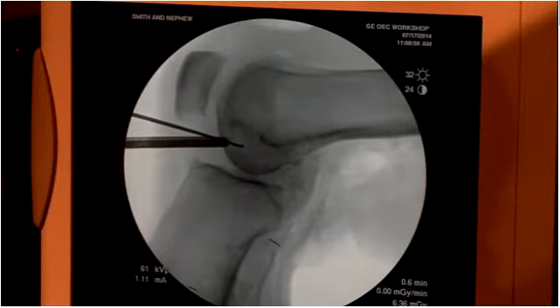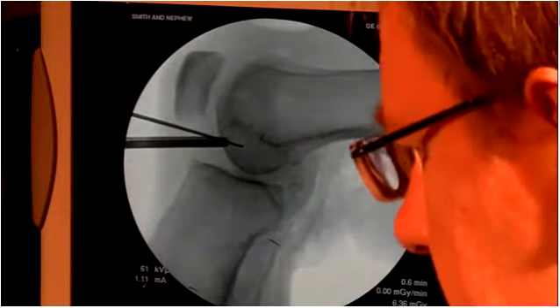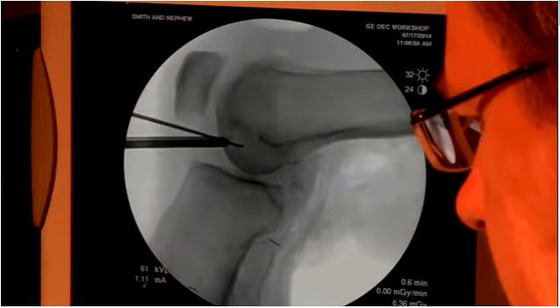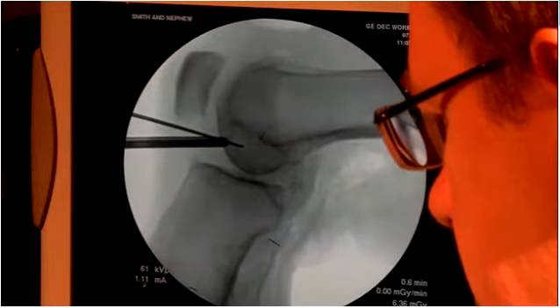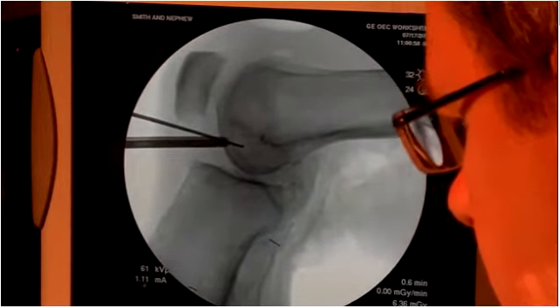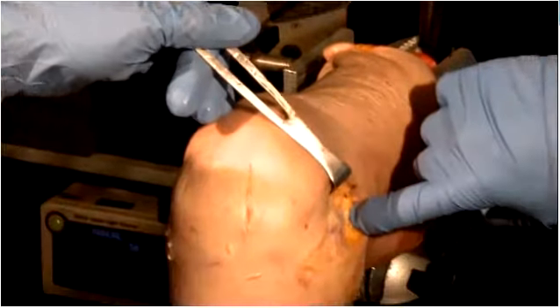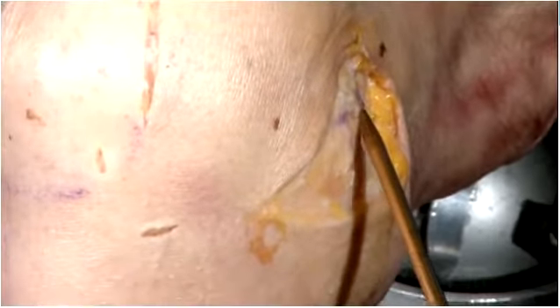Okay. So now we're going to go to the medial side, and Roman, let's take us through the MPFL, because that's what most of you guys are using this for. So I've made an incision here, and Roman, I've dissected out the adductor tendon, which it's difficult for you to see, but why don't you show us with the microfracture awl the positioning for the MPFL? Okay, so can you do fluoro, please?